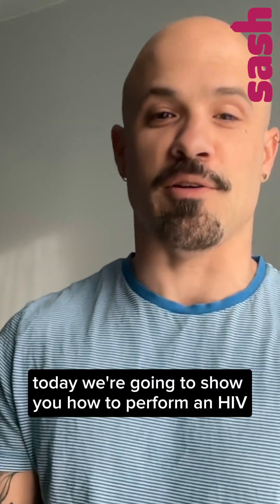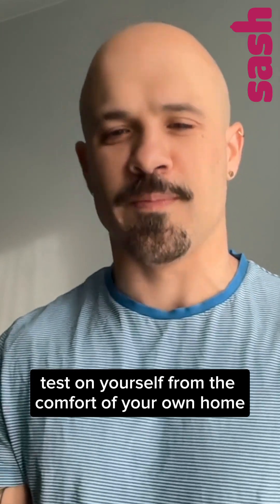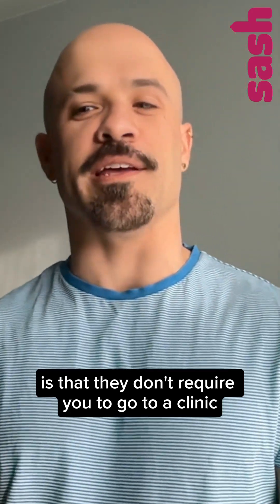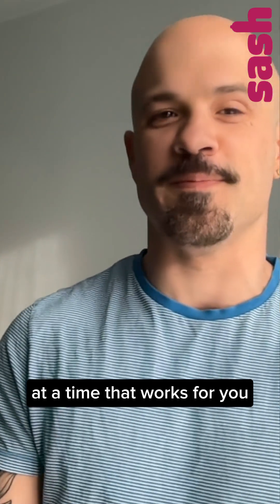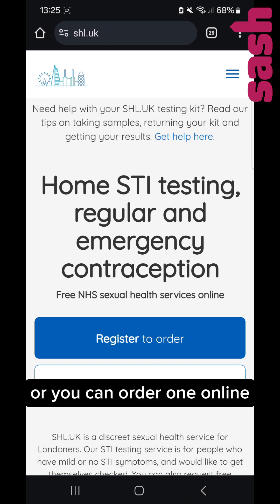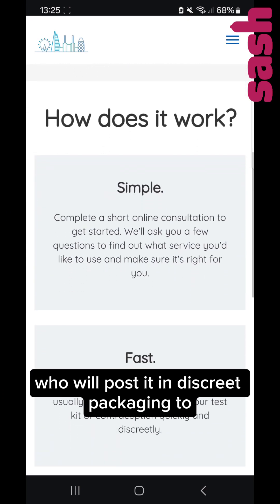Today we are going to show you how to perform an HIV test on yourself from the comfort of your own home. The great thing about test at home kits is that they don't require you to go to a clinic. You can do the test yourself in a space you are comfortable and familiar with at a time that works for you. You can get a test at home kit from a sexual health clinic or you can order one online free from Sexual Health London, who will post it in discreet packaging to your chosen address.